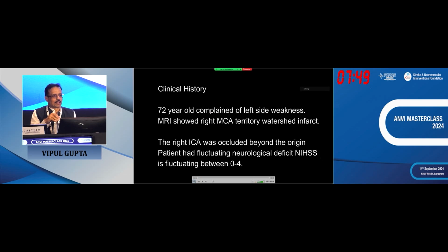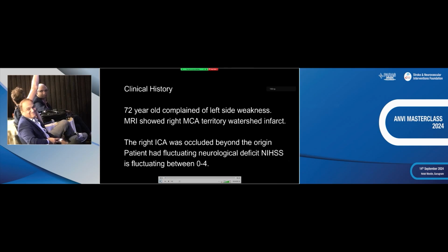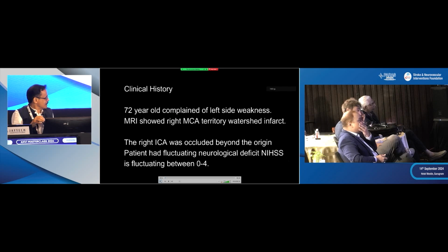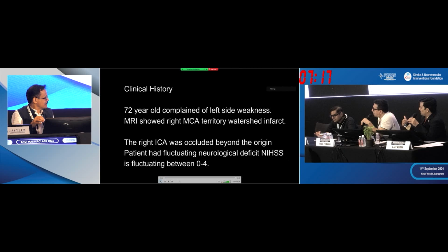Let's have a raise of hands among the audience. How many of you stent the atherosclerotic tandem occlusions, with stenting as the first approach? I'm raising my hand just to ask. I don't do it. All right, few. And what about the dissections? Do you like to stent them after recanalization? Actually, the question would have been the collaterals plus tandem occlusion. The collaterals are there because of the individual patient.